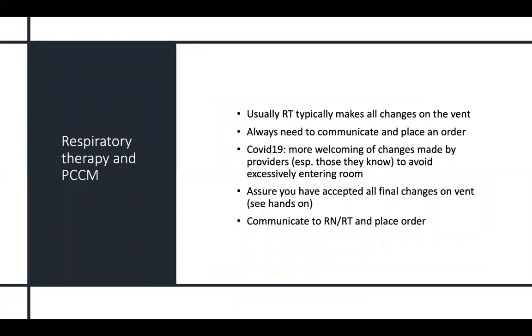During this pandemic, to minimize the amount of entries into the room, oftentimes if we find someone overdistended, we may leave someone on lower PEEP, and at least up until now, though I can't speak for all the RT groups, as long as we communicate and place orders for changing the PEEP while we're in the room, the RTs are more than happy to have us do it because it avoids entering and potentially risking contamination to person and use of PPE.